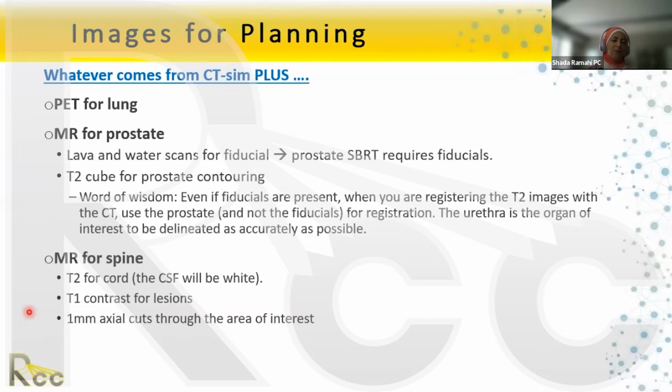It takes a lot of cooperation and coordination with the diagnostic imaging department, so we're not always successful in having this workflow done. However, if we ask them to just concentrate on where we want the scan to be done. And this is very important because the spine is curving, right? So you don't want to be worrying about doing different cuts of the spine. And then what do we do for registration? You just focus on that part of the spine.